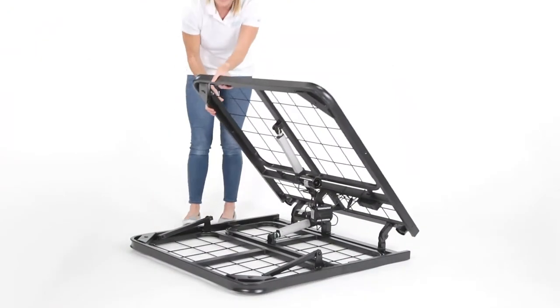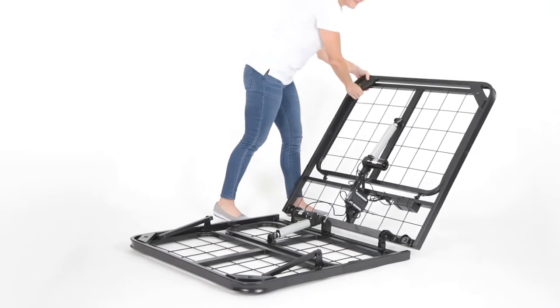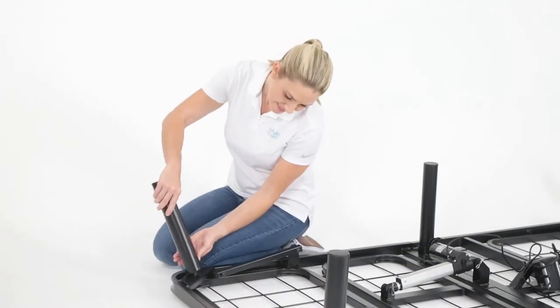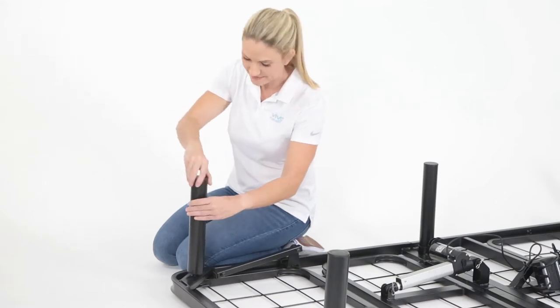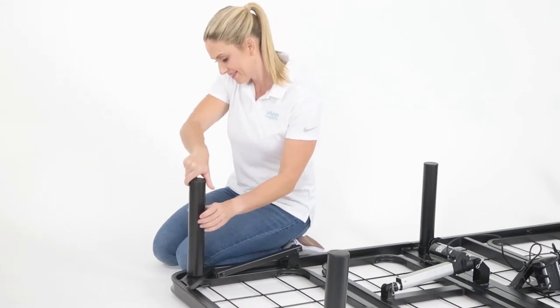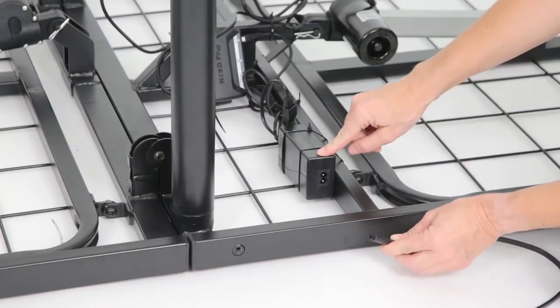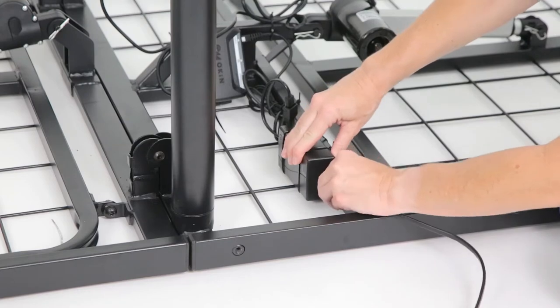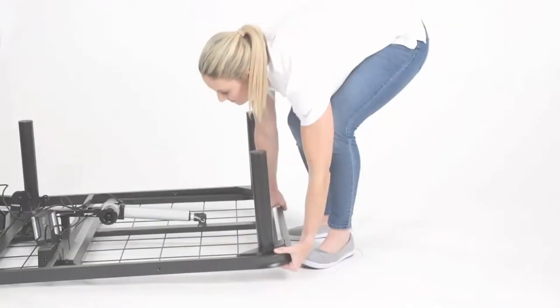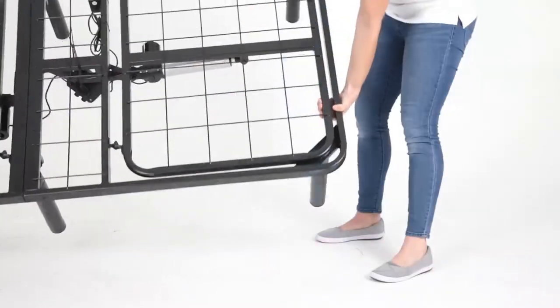To assemble your electric bed frame, start by unfolding the bed. Install and hand tighten the six legs into the bed frame. Connect the power cord to the receptacle located at the bottom of the bed frame, making sure the cord is connected completely and securely. Next, turn the bed over so that it is standing on its legs.